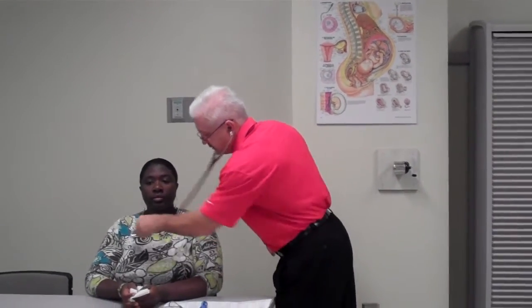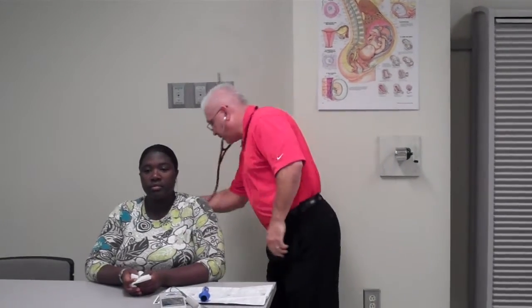No. At this point, I would go ahead and check her heart rate, respiratory rate, sat, color, level of dyspnea. I'd listen to her breath sounds again. I'd have her breathe in and out deep. 4 on the front, 4 on the back, 2 on the lower sides.